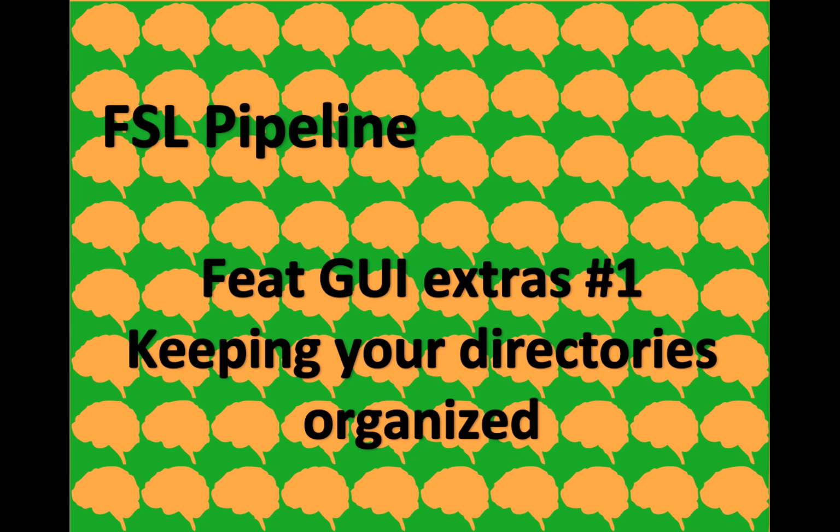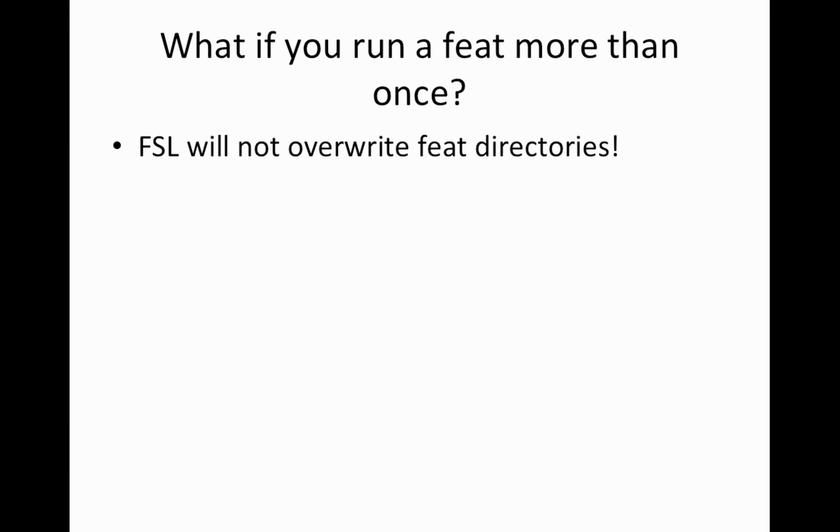All right, so I'm going to have about 5 to 6 little short videos about this first level feat analysis that we've set up, explaining some of the choices that were made. But one thing that is definitely worth mentioning is how to keep your directories organized. And this has a little bit to do with how feat works and just general good practices.